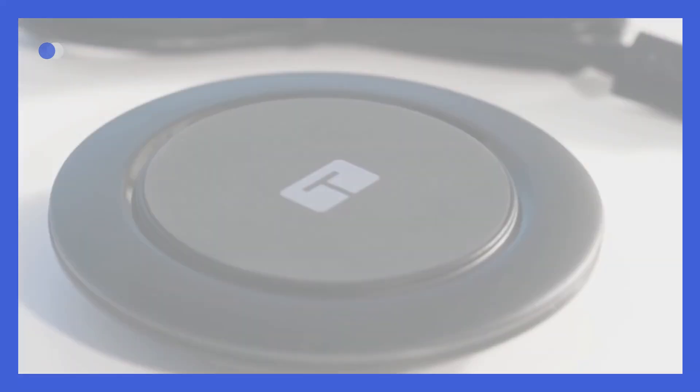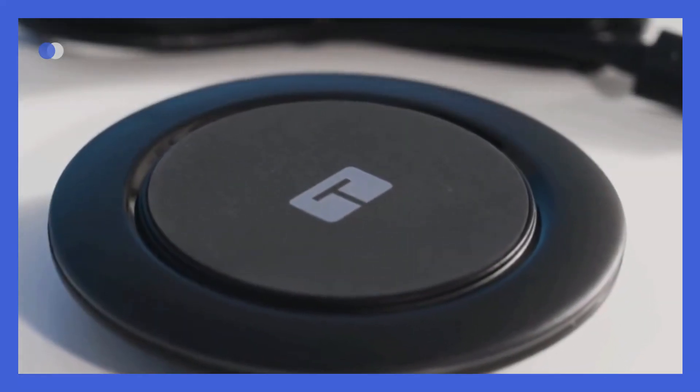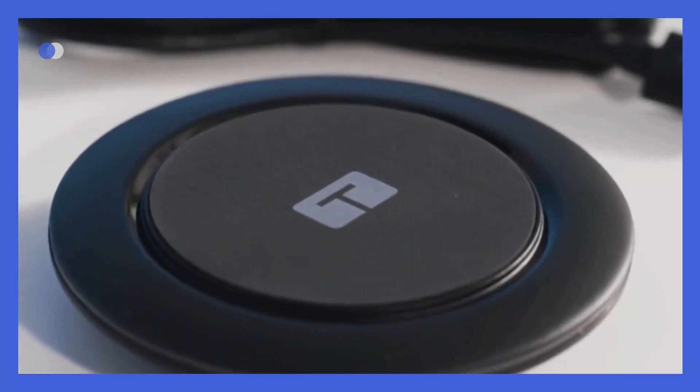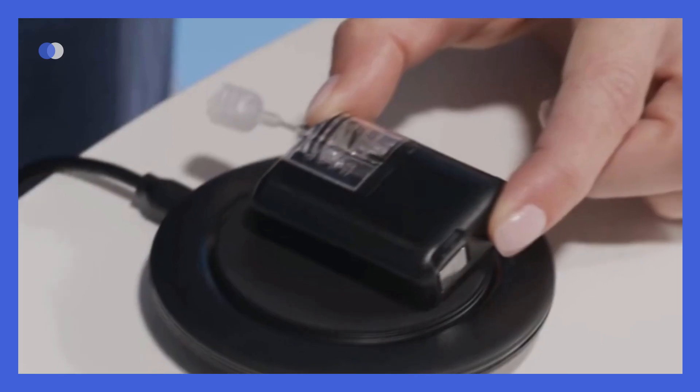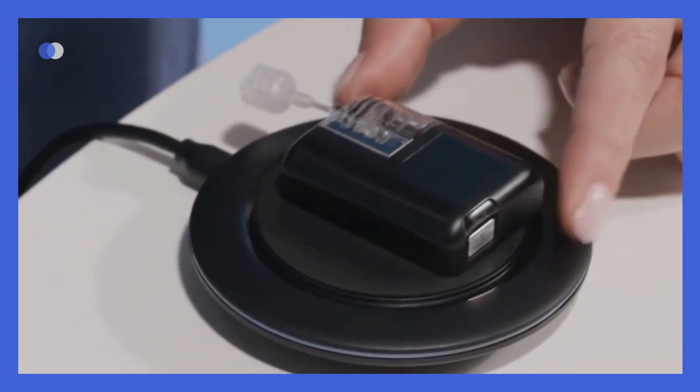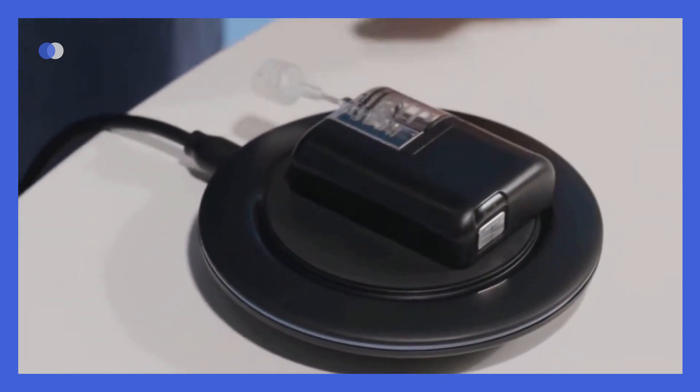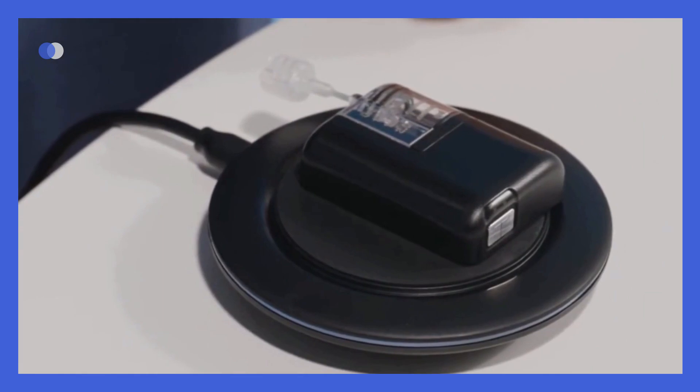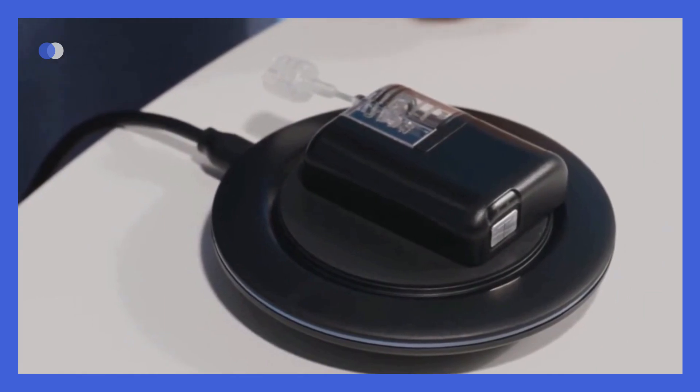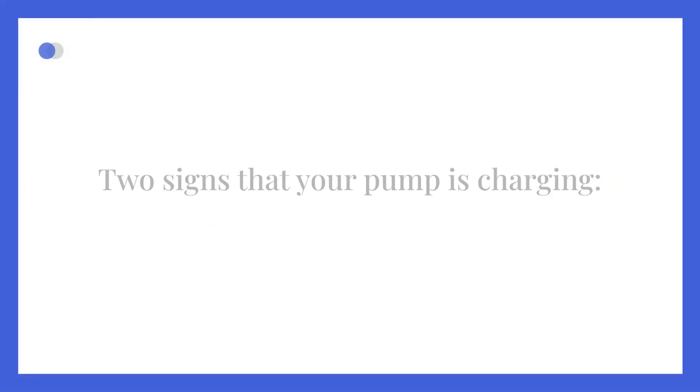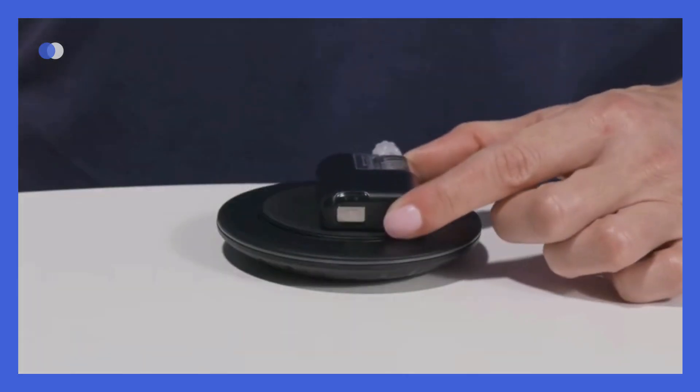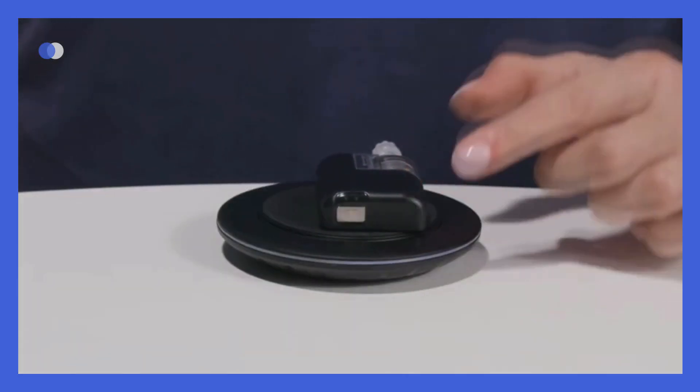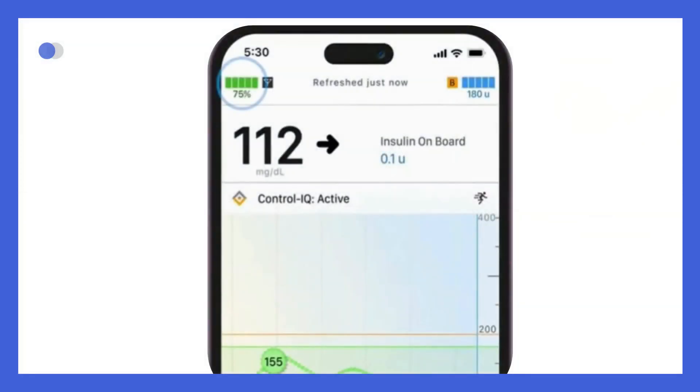While charging your system, make sure the inductive charging pad is plugged into a functioning wall outlet. There is a logo on the back of the pump and a T logo on the top of the charging pad. Align these logos and note that the pump will not be centered on the pad. There are two signs to look for that your pump is charging. First, the charging pad will briefly light up. Second, you'll see a lightning bolt icon on the top of the battery symbol in the upper left corner of the Tandem Mobi mobile app.